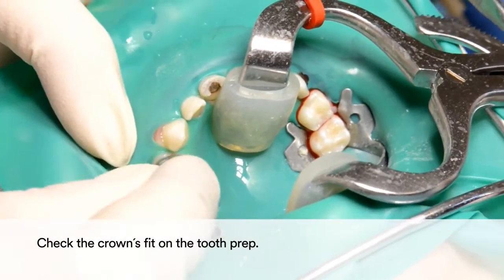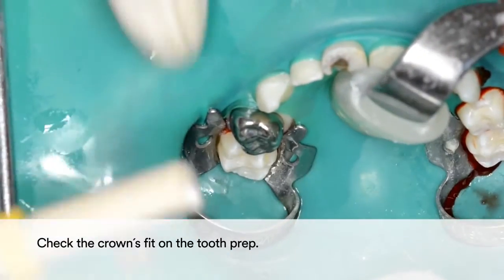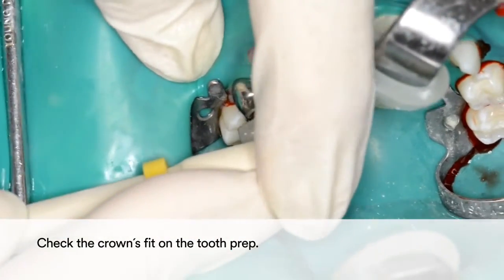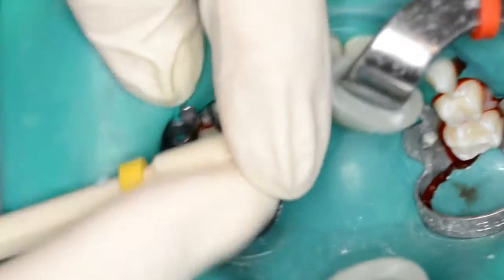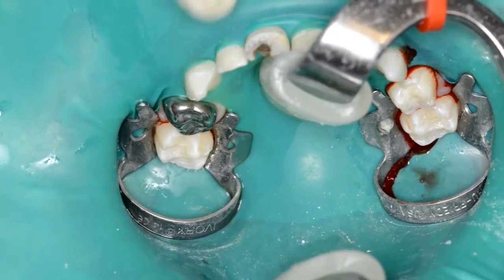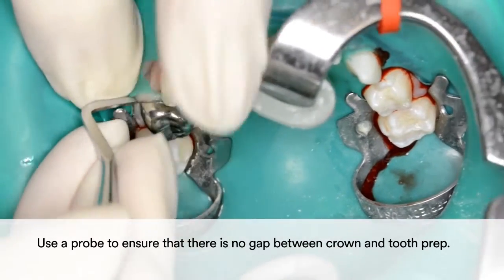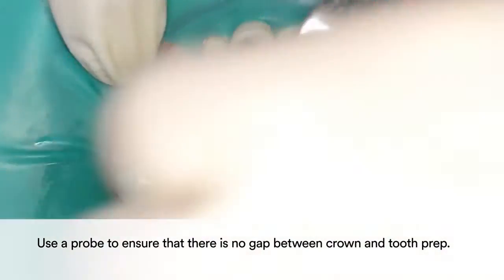Prior to placing the crown, check its fit on the tooth preparation. Use a probe to ensure that there is no gap between the crown and the tooth prep.